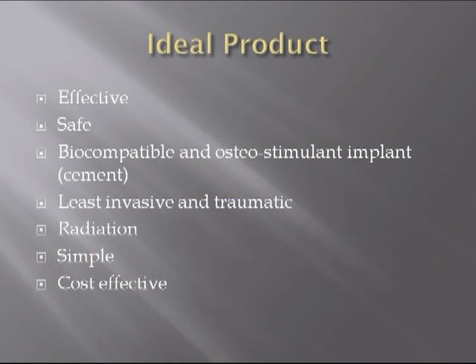We just combine different products for different cases to get the best result for the patients. So ideal would be effective, which we achieve with most of the procedures, safe and more biocompatible or osteostimulant implant, cement, the least invasive and traumatic, and the least radiation to the operator and to the patient, simple and cost-effective.